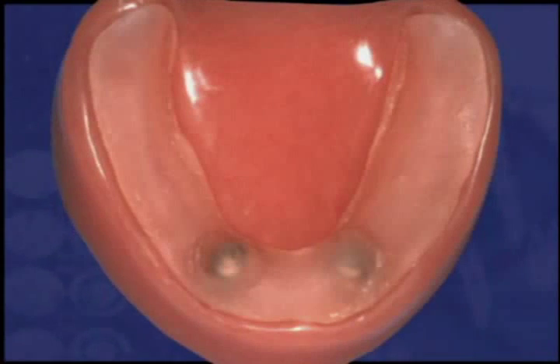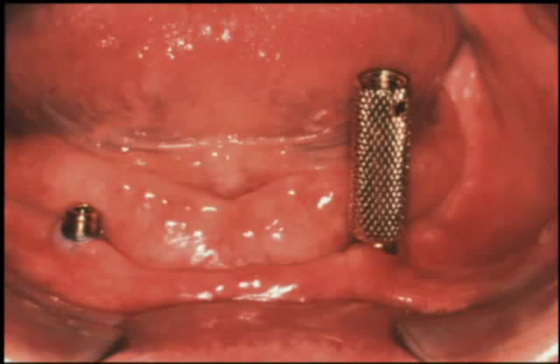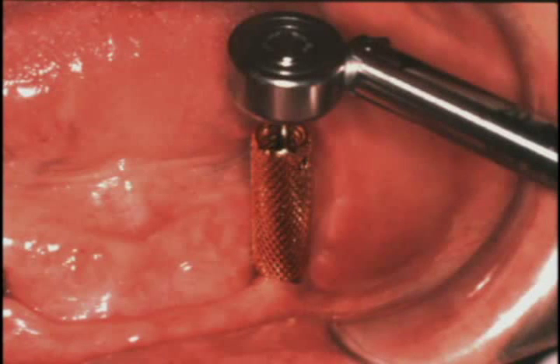The self-aligning ability of the locator implant attachment aids the patient in orienting their prosthesis, which is vital with a severely resorbed mandibular ridge. This patient referred to Dr. Schneider has two externally hexed mandibular implants. The gingival level surrounding the implants was very shallow, with the hex of the implant extending above the crest of the tissue on the patient's right side. With limited space available, use of the shortest attachment possible was indicated. Locator abutments having the lowest tissue cuff height were placed using the abutment driver, with a torque wrench used for final tightening to 20 Newton centimeters.